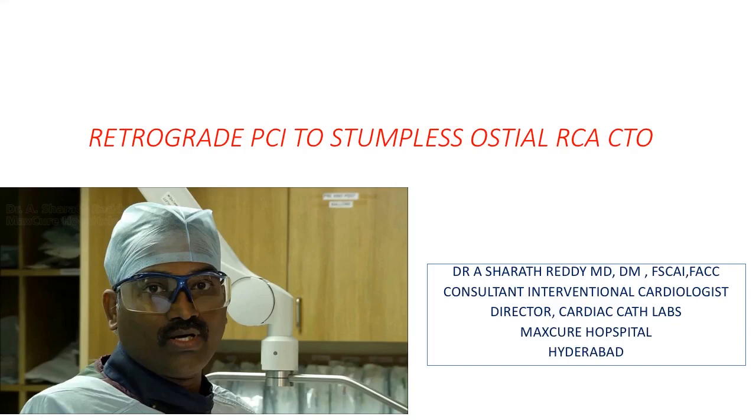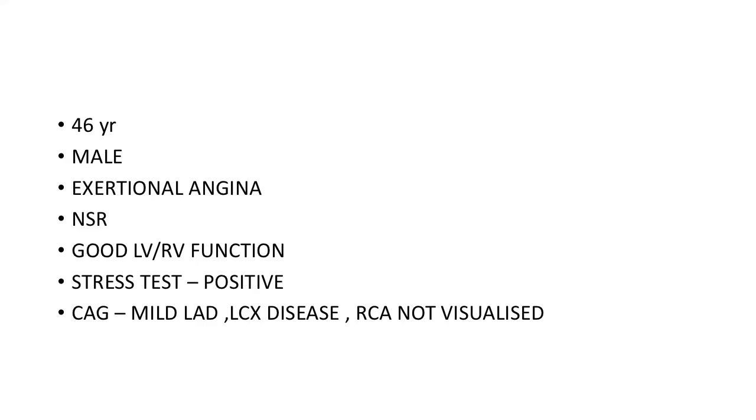Today, I will discuss one case which we have done recently, a case of stumpless ostial RCA CTO, which we have done percutaneously in a retrograde way. This patient is a 46-year-old male, came with exertional angina, had normal sinus rhythm and good LV function. His stress test was positive, for which an angiogram was done, which showed mild LAD and LCX disease, and the RCA couldn't be visualized in the angiogram.